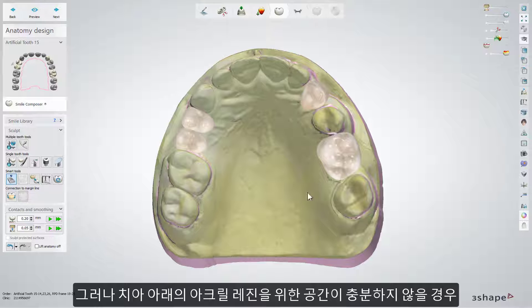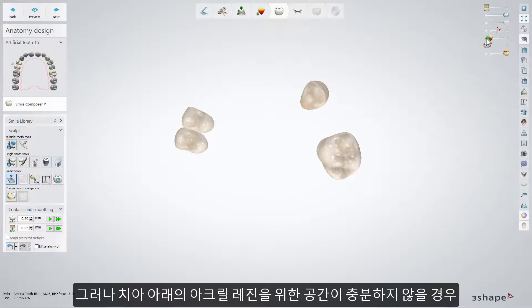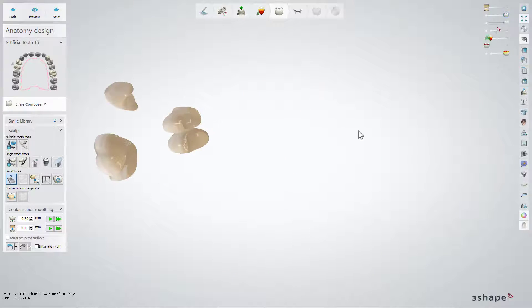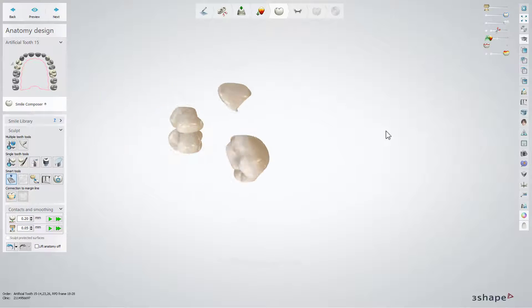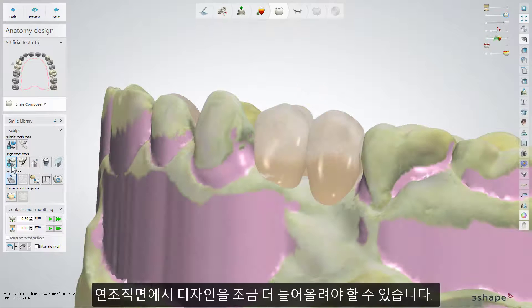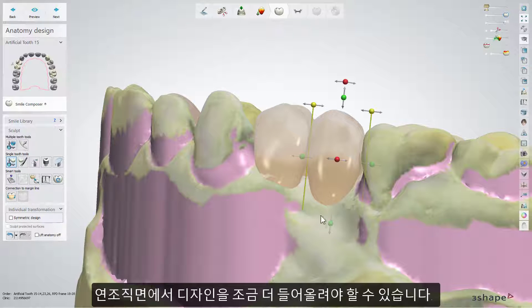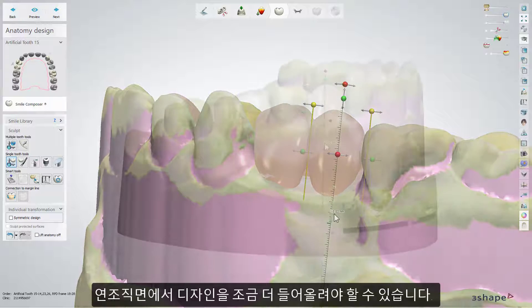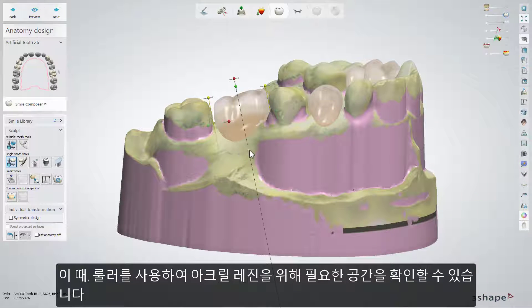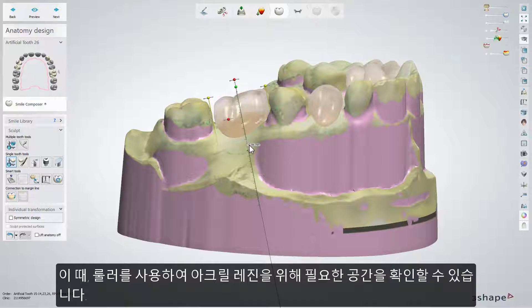The space gap, however, might not be enough for the acrylic material under the teeth. So what you could do now is to lift the design from the tissue side a little bit higher. Using the ruler, you can define how much space you need for the acrylic material underneath.